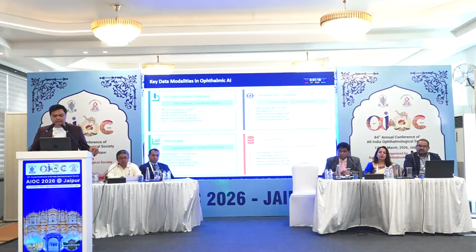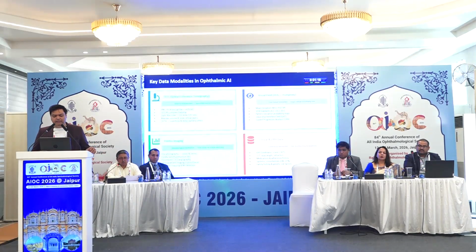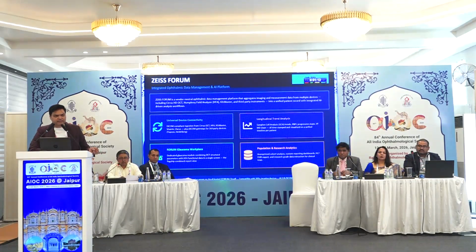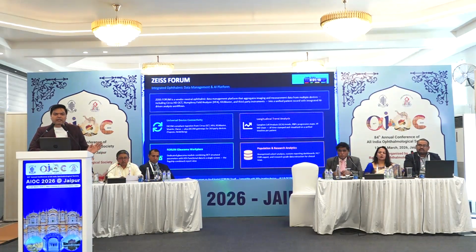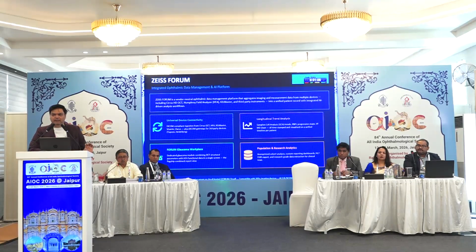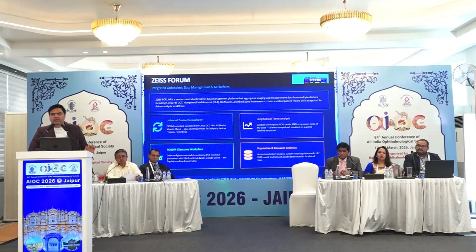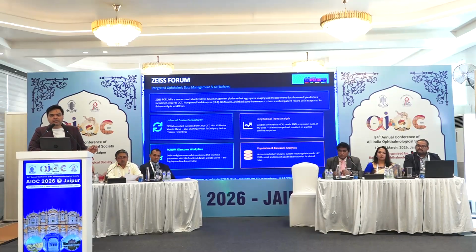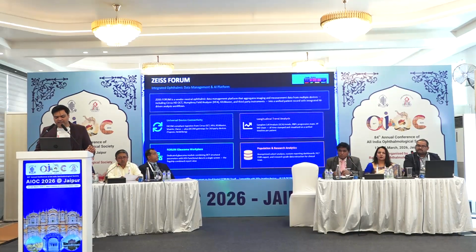So as I told, it is OCT, visual field, the fundus imaging, and the clinical data. What I use is Zeiss Forum. Lucky or unluckily, in India, it is the only one that is available commercially and widely. Heidelberg has their own setup, Topcon also has their own setup, even Optopol has their own setup, but they are not available as widely.